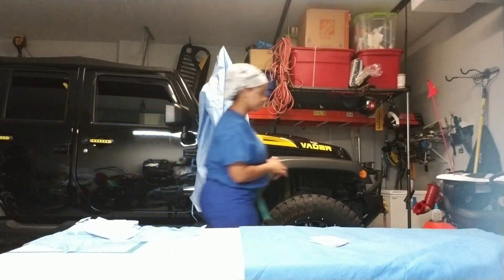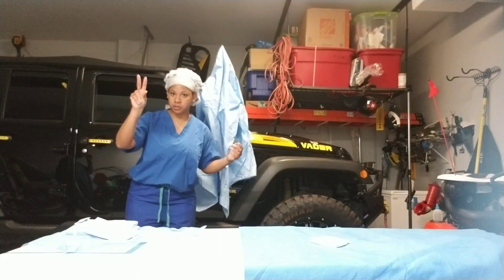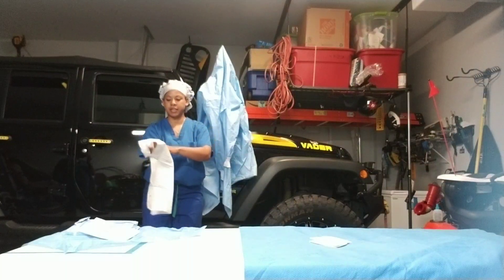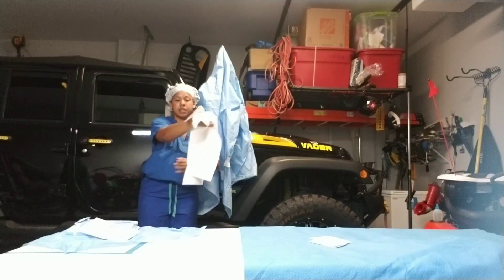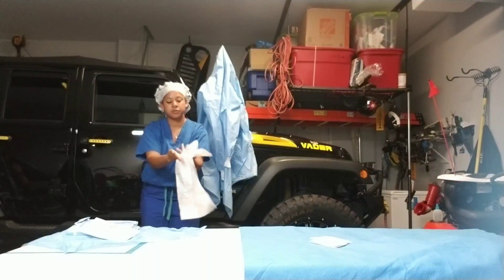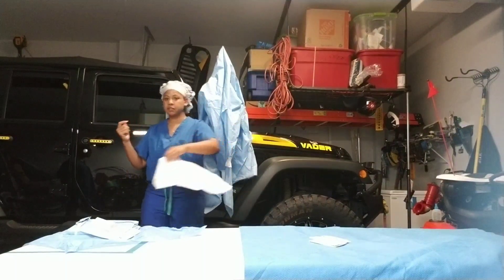Now I'm going to scrub. I'm going to grab — use my pinchers — grab my towel and step back. Open up my towel, put it across my hand, fingers. Hand, hand, and then blotting down my arm, not going back up. I'm going to come under my towel and drop, bring my other hand on top. Dry my fingers, dry my arms. I'm standing with my arms out and my butt out, making sure not to touch anything around me. When I'm done, I'm going to throw it in the trash.